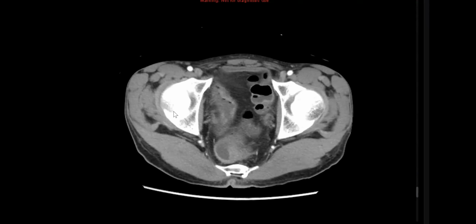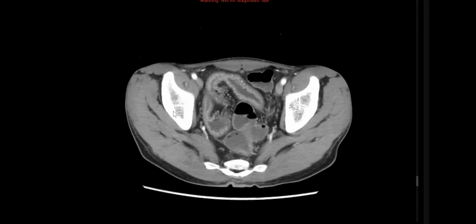Very good, my friend. So the diagnosis in this case and management? I will convey the findings to the referring physician for medical therapy and follow-up. Okay. How to follow up this case? I think MR enterography. Excellent, very good. Any check for specific activity, laboratory test for Crohn's disease?